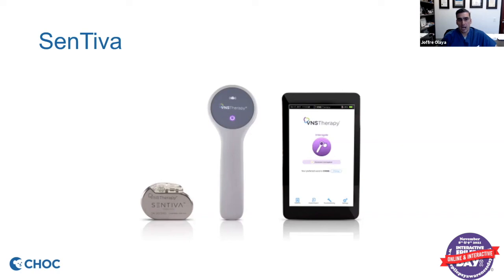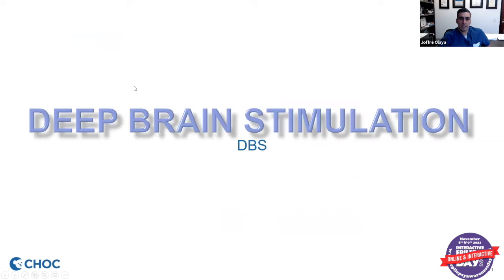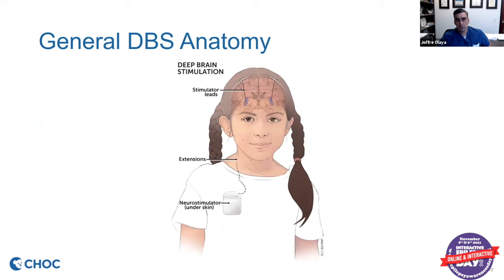So now we'll talk a little bit about the deep brain stimulator. So again, this device is at this point just FDA approved for adults. It was just approved last year. For the DBS, there's a couple of different targets in the brain that people have used to help treat seizures. Most common targets are in the thalamus, and the big study that was done that led to the FDA approval was a SANTE trial, and they were looking at electrodes that were placed in the anterior thalamic nucleus.